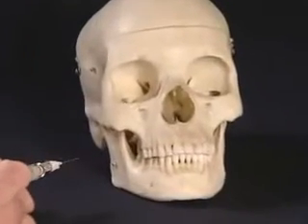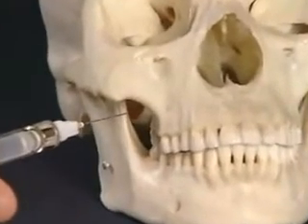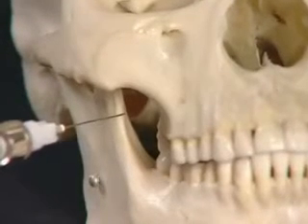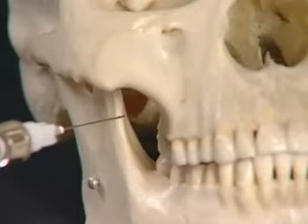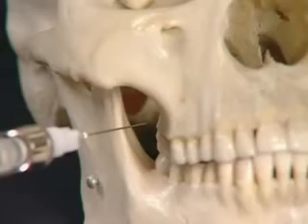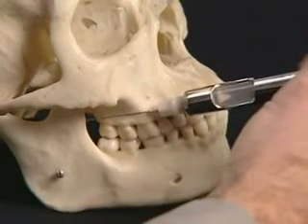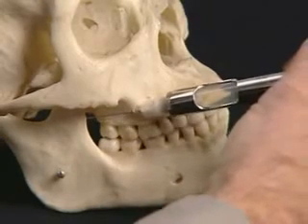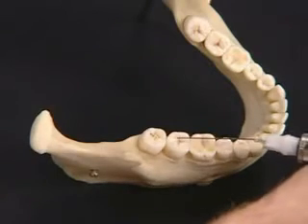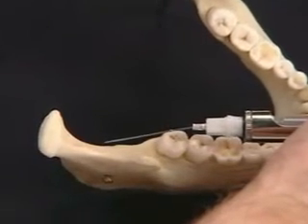It's important to begin with knowing where the anterior border of the ramus is, and that should be palpated, and then the coronoid process noted. The coronoid process marks the lateral border of where you would want to insert the needle, and the needle insertion goes between the coronoid process on the lateral and the maxillary tuberosity on the medial. The correct angle is assessed by making it parallel to the occlusal plane, and then the needle is advanced posteriorly, parallel to the occlusal plane, until you've advanced 25 millimeters. The needle should be advanced straight back, taking advantage of the arc of the needle and advancing it slightly posteriorly without actually touching bone.